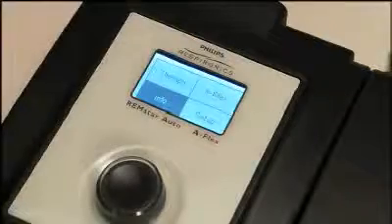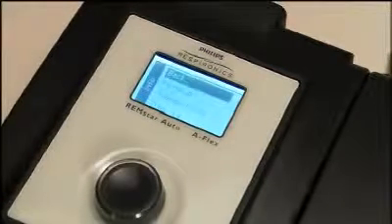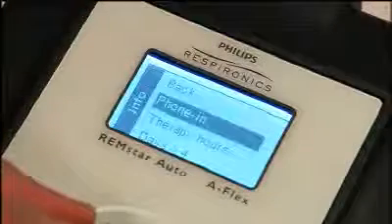Sometimes a home care provider will ask for information about your PAP therapy. To get this data, highlight info on the main screen and press to select. You are not able to change any of this data.